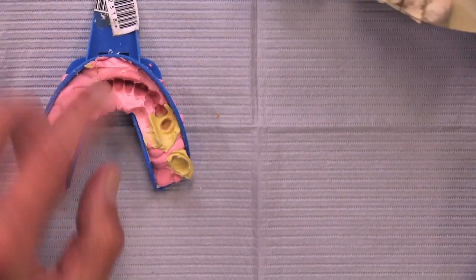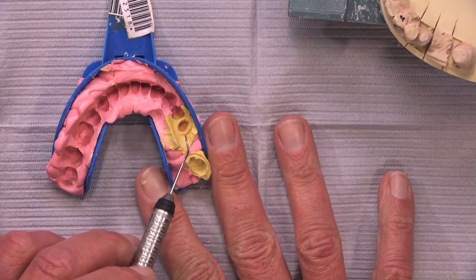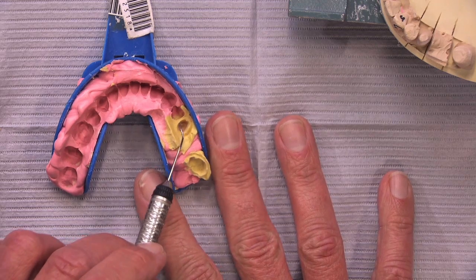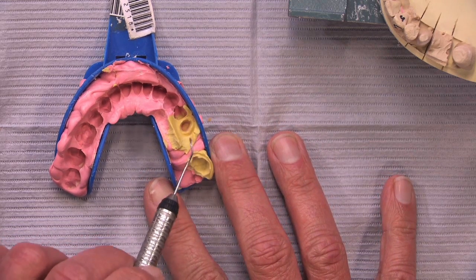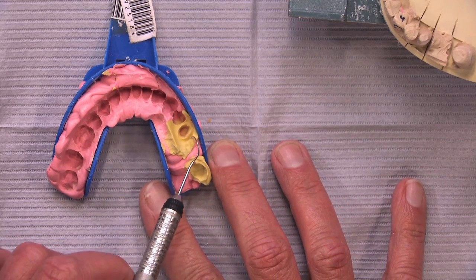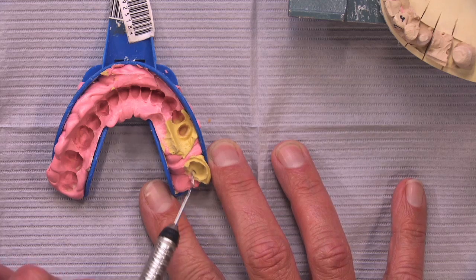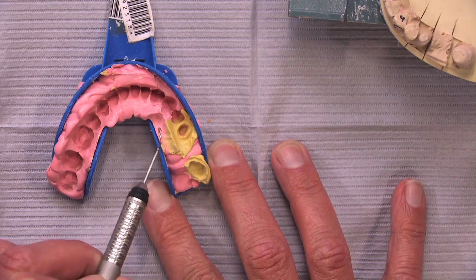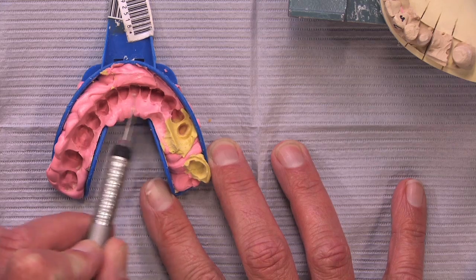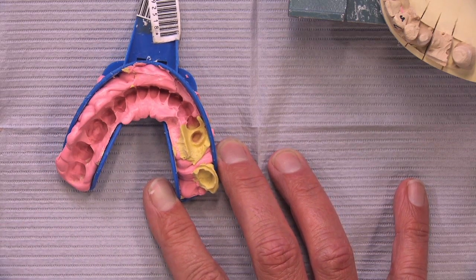So it just caught my eye as I walked by, and usually when you see a bridge impression, you will see the same colored material go from prep to prep. And when I saw this hole in the middle, I thought that's an interesting place to not have enough syringe material, and you really have to be trying to minimize how little syringe material you're going to use here, which is fine, again, in a simultaneous impression. But if you're going to do a two-step impression like this, we need a lot more. And frankly, we'd like to see the rest of this maybe hollowed out a little bit with some more syringe material around there as well.